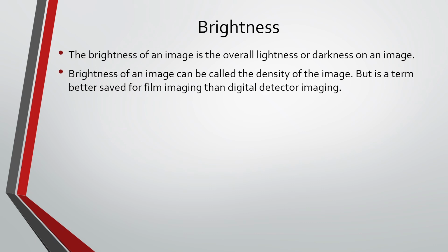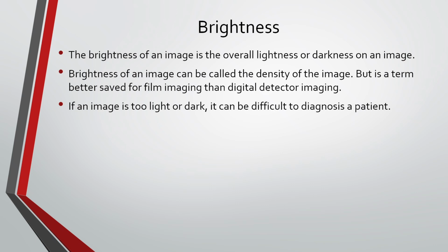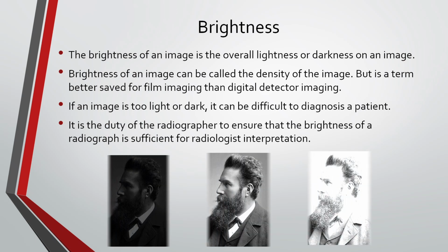This may be a term that's used, but the term is better saved for film imaging. In texts that have been around a while, you may see density. It's not necessarily incorrect, but it's better used for film imaging than digital. If the image is too light or dark, it can be difficult to diagnose the patient. So we need the correct amount of brightness on the image. It's the duty of the radiographer to ensure that the brightness of the radiograph is sufficient for the radiologist's interpretation.